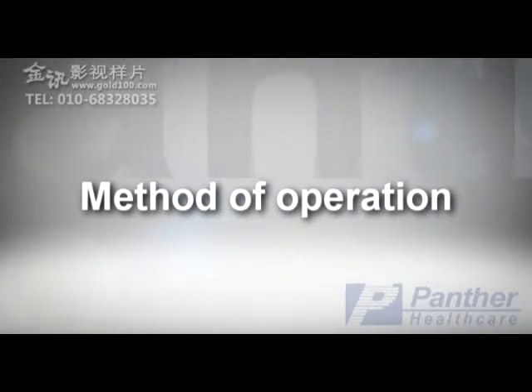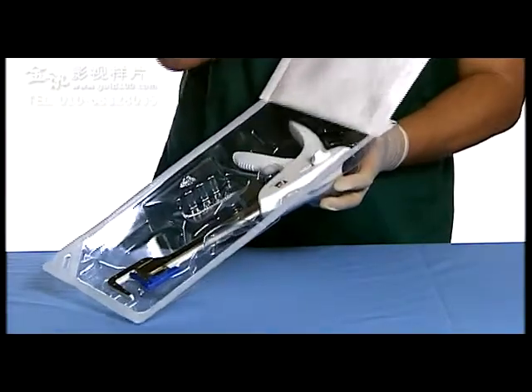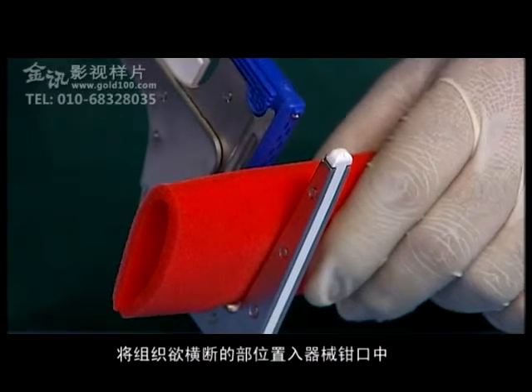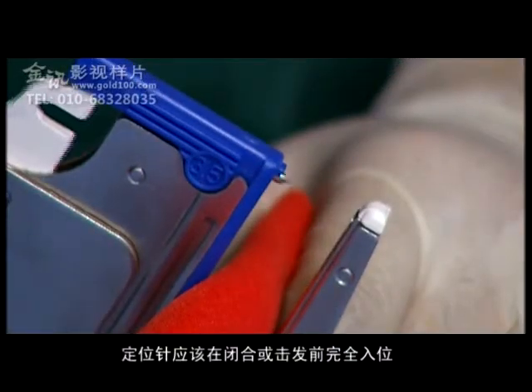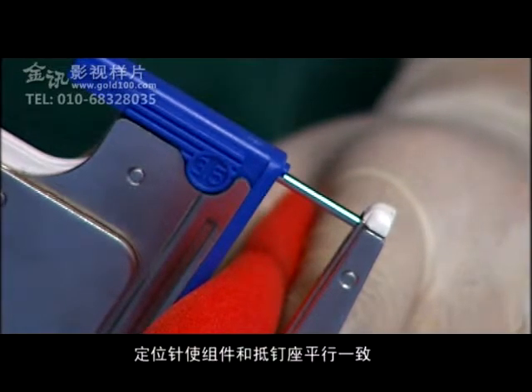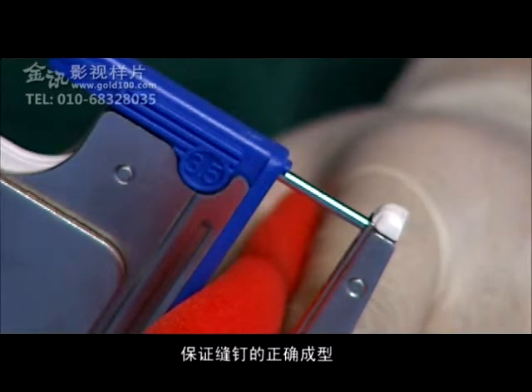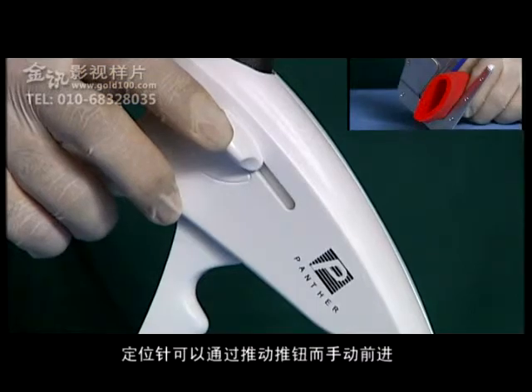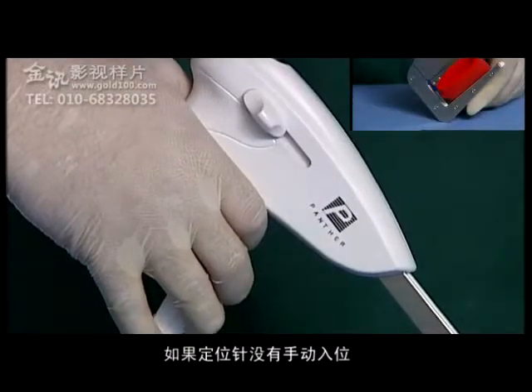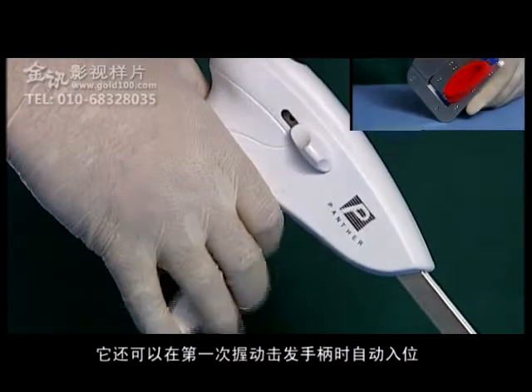Method of operation: Place the instrument jaws around the tissue at the point of transection. The retaining pin should be properly seated prior to closing or firing the instrument. The retaining pin aligns the cartridge and anvil to ensure proper staple formation. The pin can be manually advanced by pushing the retaining pin button forward. If not seated manually, the pin will automatically seat with the first squeeze of the handle.